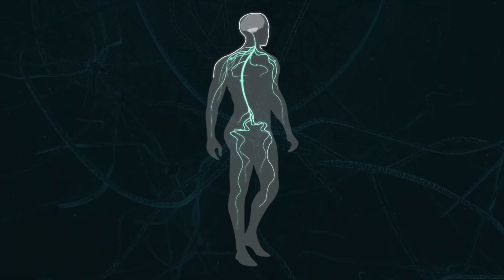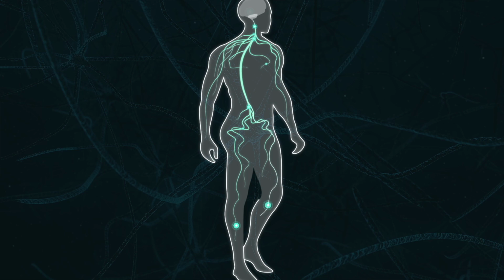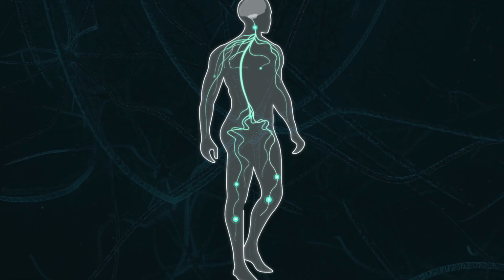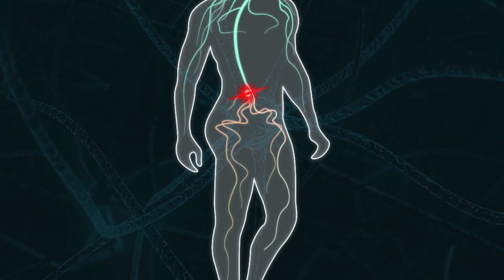When an able-bodied person wants to complete a movement, it's initiated at the brain level and follows along a neural pathway to the body part that they're trying to move. When a person's experienced a disease or a disorder such as progressive neuromuscular disease, that pathway is impacted and they're unable to complete a feedback loop that helps them successfully complete tasks.